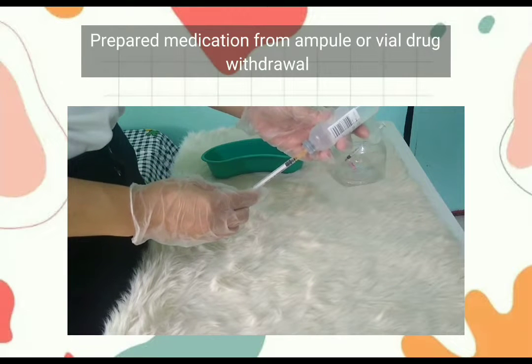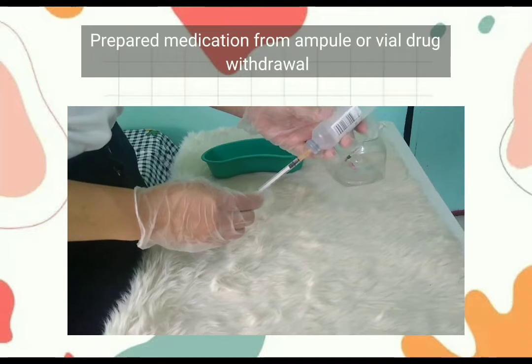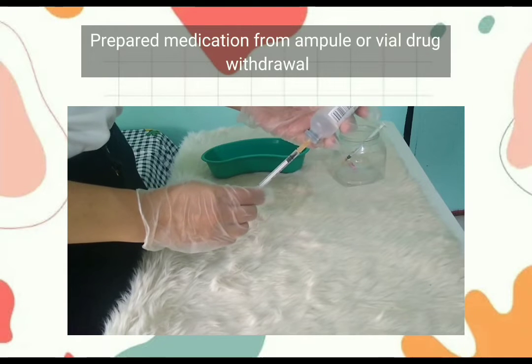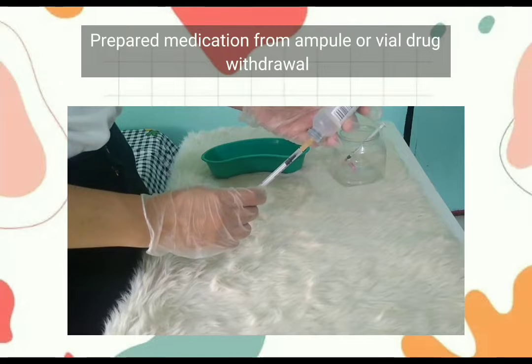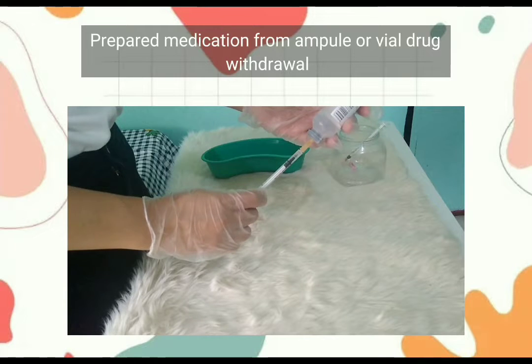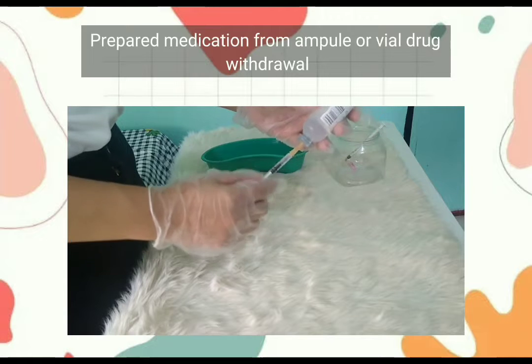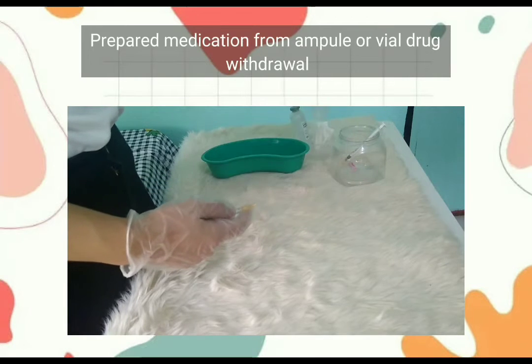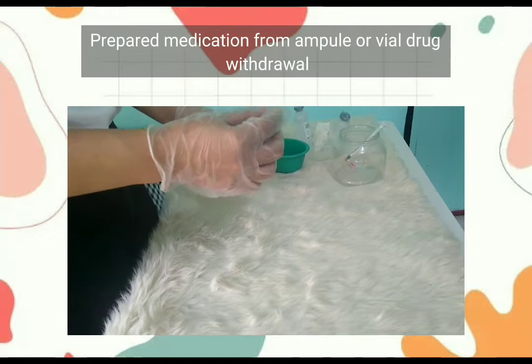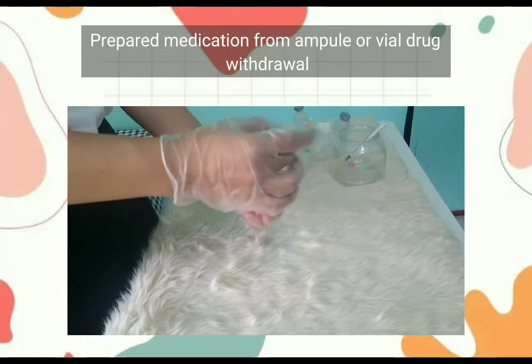And getting enough sterile water as indicated. And avoid getting any bubbles.